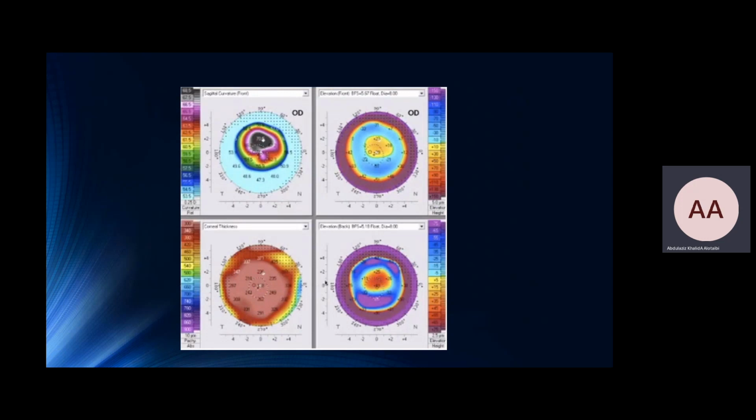Just take the epithelium. And by the way, with this patient, you should advise the patient to wear protective glasses, like polycarbonate glasses. Any minor trauma may cause a rupture and then you cannot close it. Trust me, you will never close a cheese-wiring tear all over, even with glue. So be cautious when examining these patients using a Tono-Pen or whatever. If the patient comes with this, be careful touching the eye. It is a really fragile cornea.